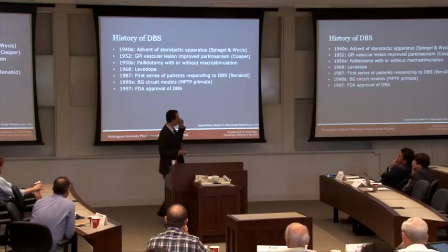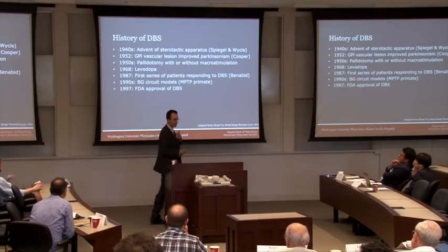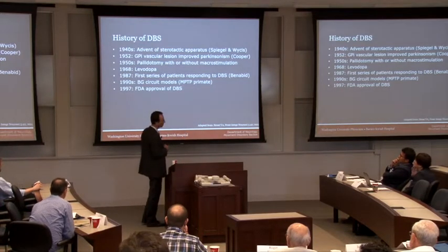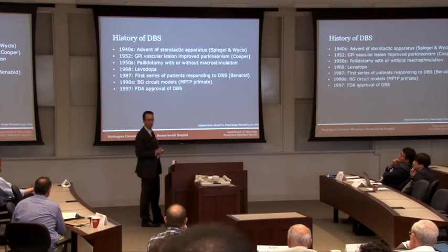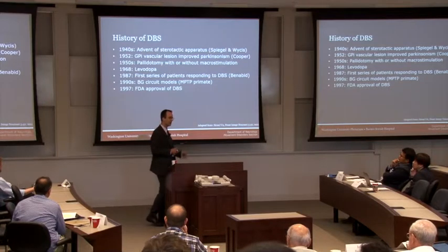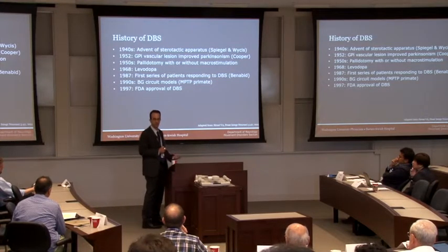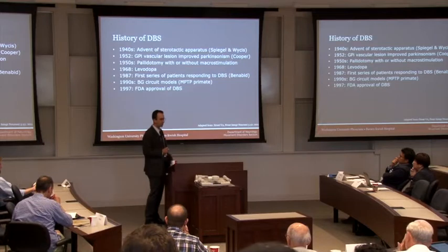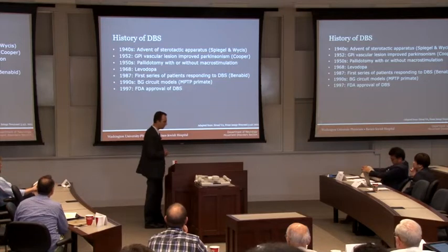The point I want to make in this slide, as far as the history, is that DBS is an empiric therapy. We, as clinicians, make mistakes and make important discoveries, and I'll explain that here. People played with electricity for a long time. In 40 AD, I think they were applying electric eels to the scalp to treat headaches. It wasn't until the 1800s that we really started stimulating the cortex, but the 1940s advent of the stereotactic apparatus really allowed us to dive deep into the brain and get a precise, accurate localization, initially to allow surgeons to create lesions in areas of the brain that cause problems.